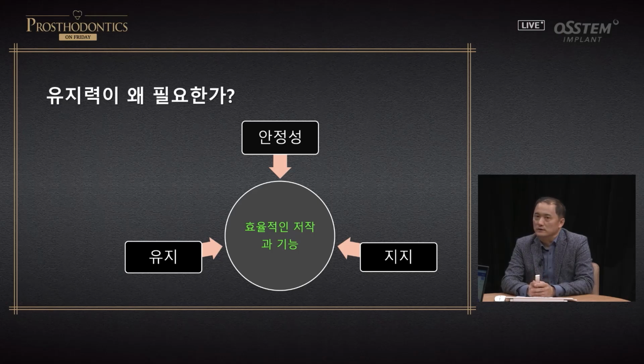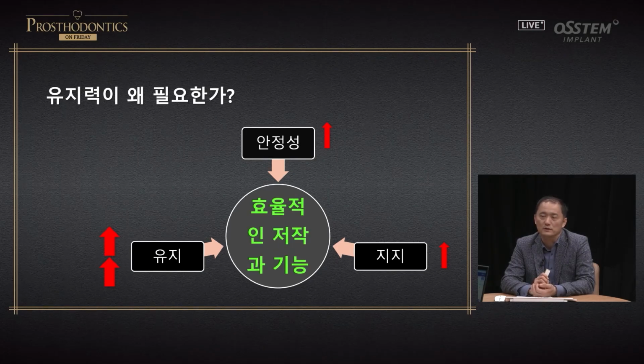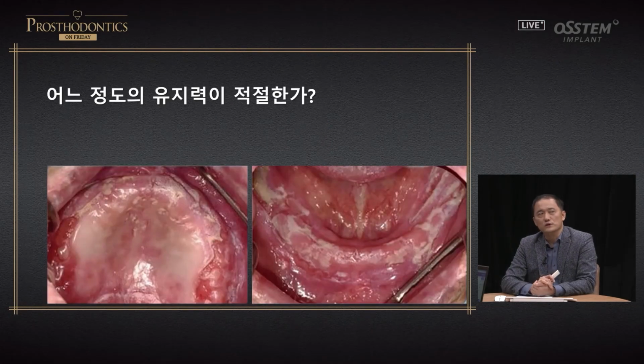Now, for efficient use of full denture, you need sufficient stability, retention, and support. So theoretically, these three concepts can be explained, but in the clinical setting, they actually are complementary to each other, maximizing the efficiency of full denture, especially as you have more support and stability, you have better retention, and this maximizes usage of denture, resulting more satisfaction of the patient, hence also to the dentist. So I think that's why we are all interested in how to retain full denture.